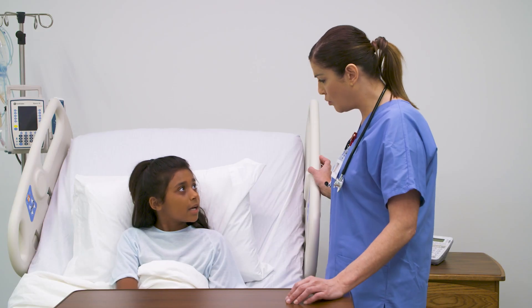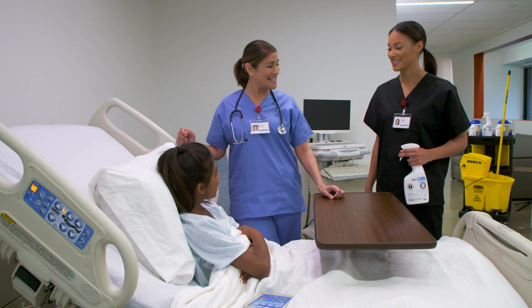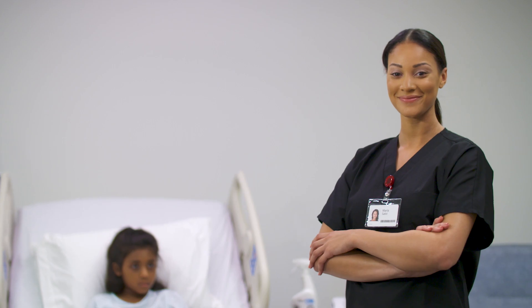PDI is committed to providing breakthrough products for your infection-fighting arsenal with ready-to-use disinfectants and advanced technologies so that you can deliver the best in patient care. Together, we got this.